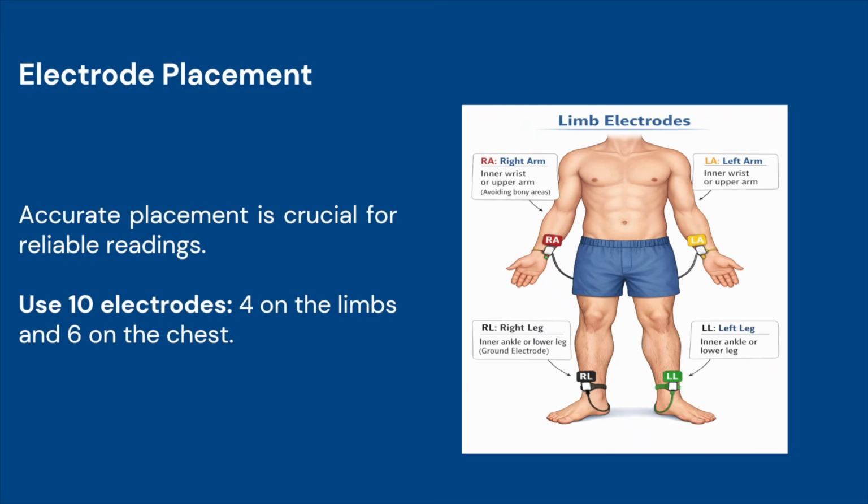Now we have come to a very important practical topic, which is the electrode placement. It is very important because incorrect lead placement can completely distort the ECG and may even falsely suggest serious disease such as myocardial infarction, which is not there.